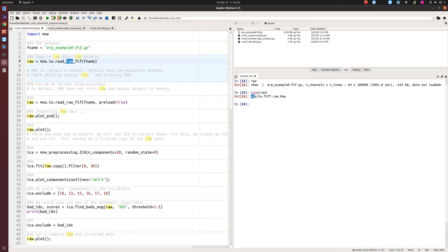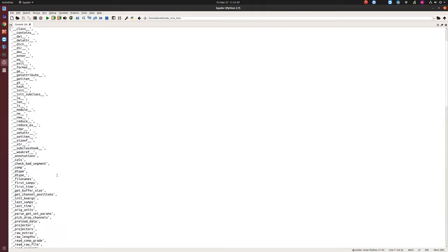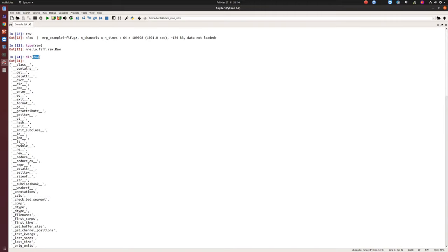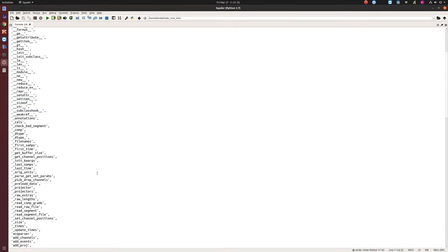The type is MNE.IO.FIF. FIF is a convention or file extension that MNE developers introduced — you need to follow their convention. Let's explore what we can do with this Python object and take a look at some properties. These are hidden attributes we don't need to bother with, and these are some semi-private ones.